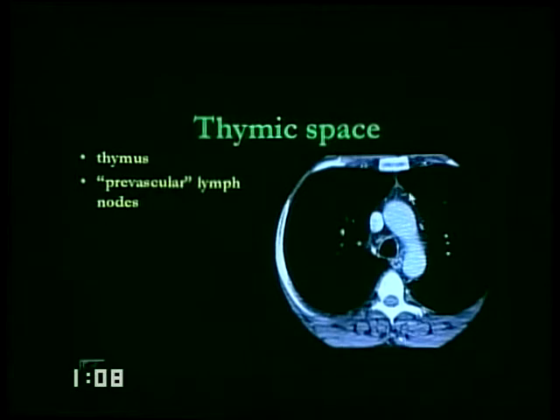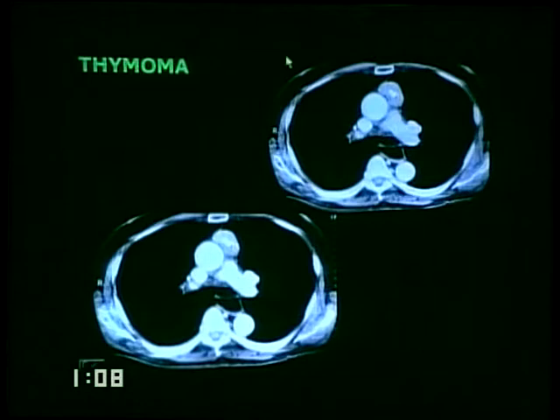This can be very silent, but you're going to pick it up more sensitively using CT of the neck, which has thinner sections and higher energy of acquisition, as compared to CT of the chest, which has thicker sections. Again, a thymoma can be localized. Malignant thymomas can be infiltrative and can encase along the pleural and pericardial spaces.